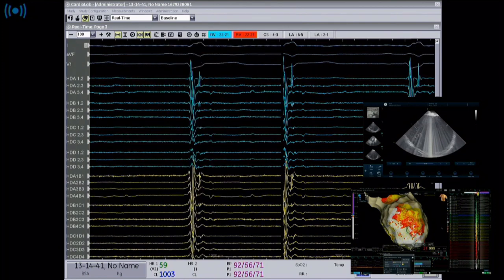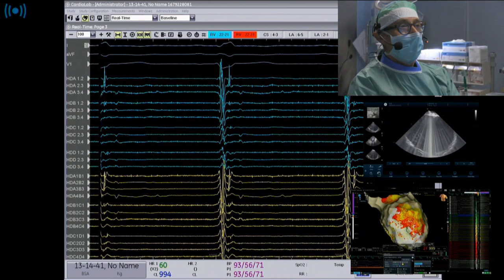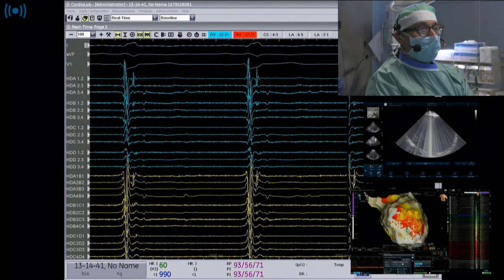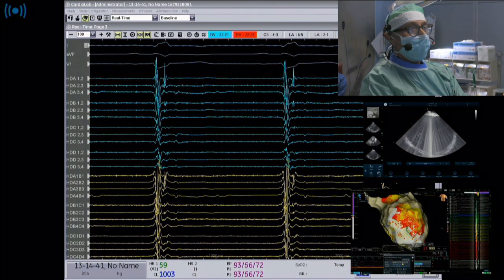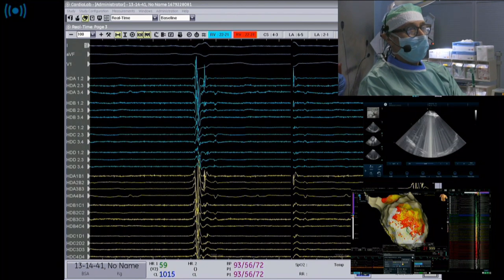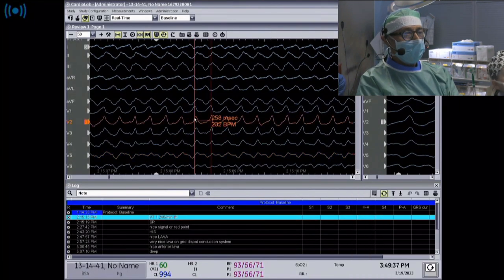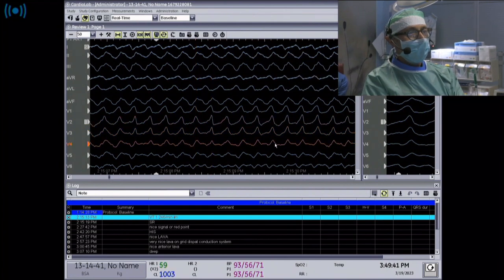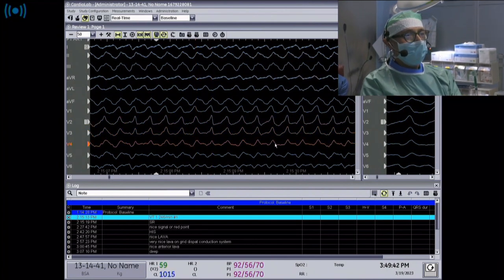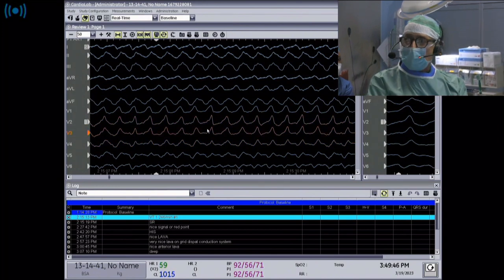We programmed stimulation to induce sustained VT, which was easily inducible by triple extrastimuli, with a cycle length that closely matched the ICD interrogation electrograms. We thought this would be a good target and went on to sinus rhythm mapping.